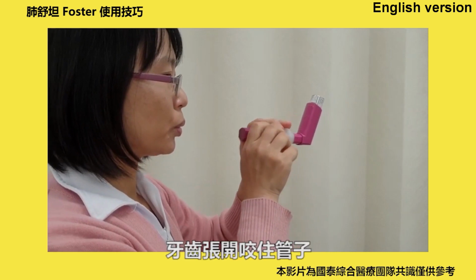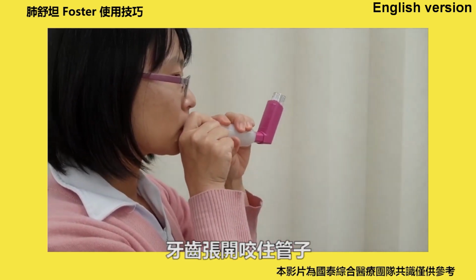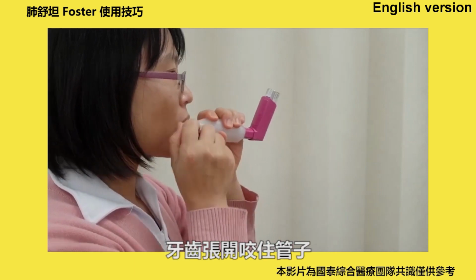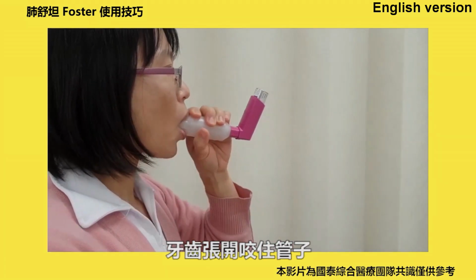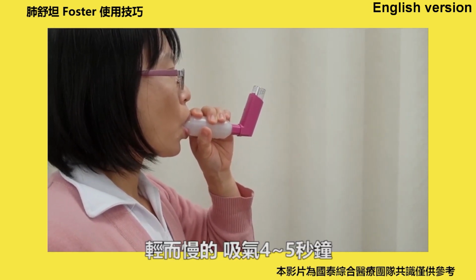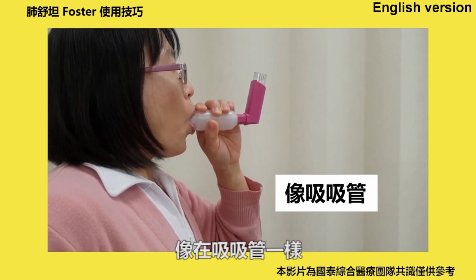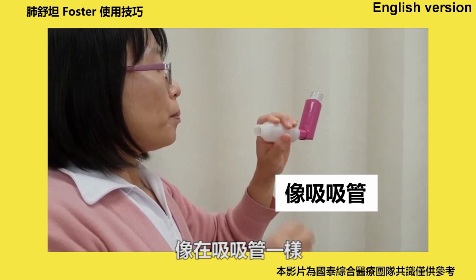Remove the mouthpiece cover. Put your lips around the end of the inhaler to make a tight seal. Place the mouthpiece between the front teeth and seal the lips around it. Keep your tongue under the mouthpiece so that it does not block the opening. Begin to breathe in slowly and deeply for 4 to 5 seconds. This action is like using a straw.